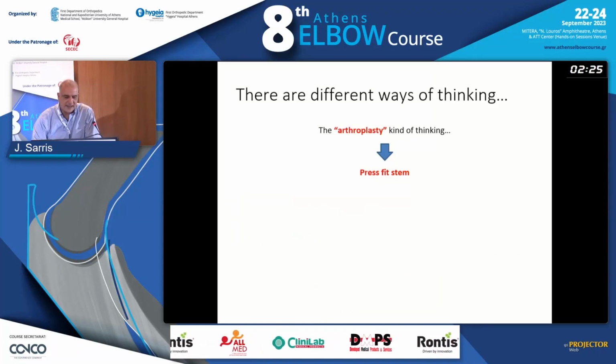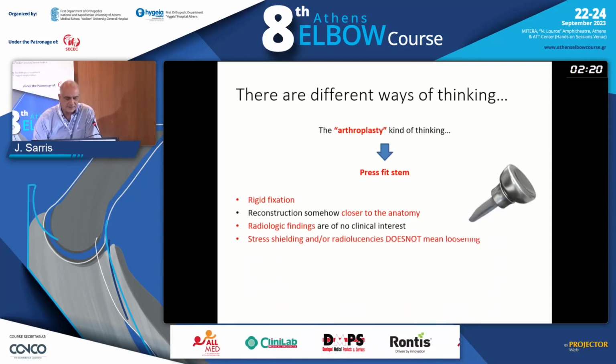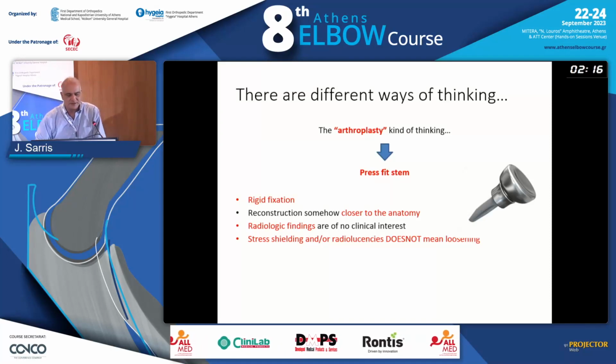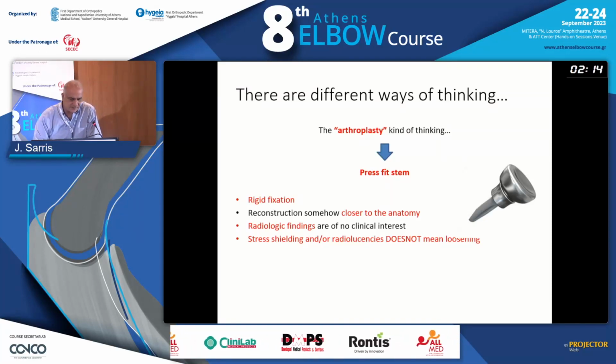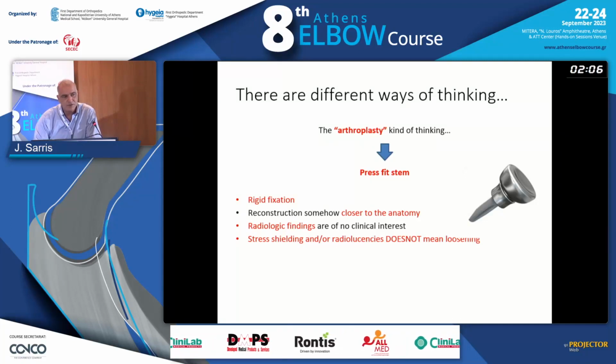The arthroplasty kind of thinking: press fit stem, like we do in all our arthroplasties, rigid fixation, reconstruction somehow closer to the original anatomy, but not exactly the same. Radiologic findings with stress shielding or radiolucencies, we find them very commonly, but do they affect the overall result?